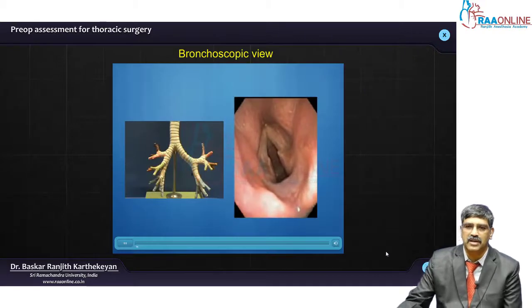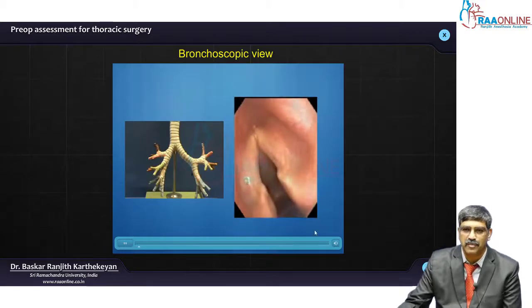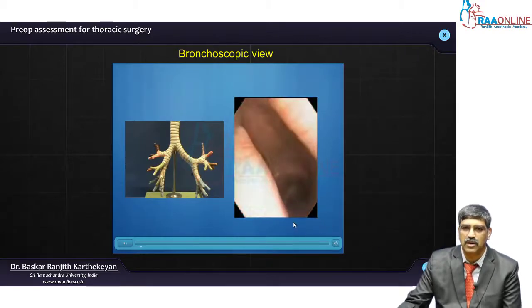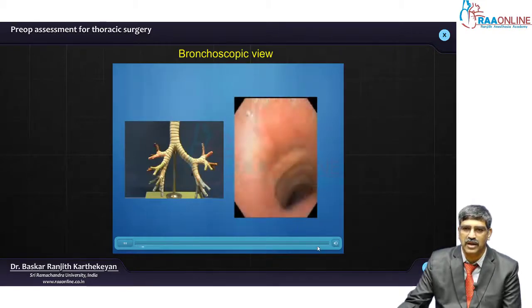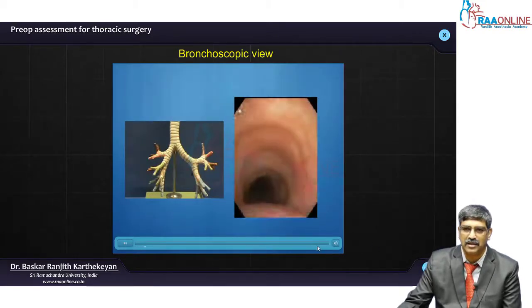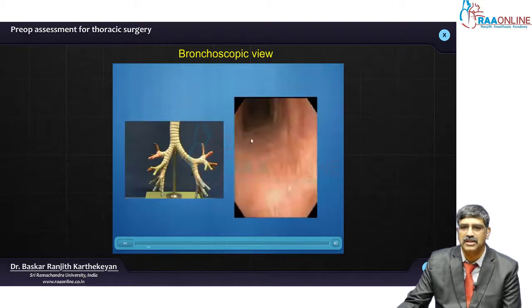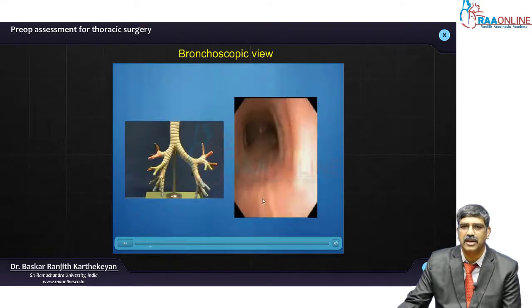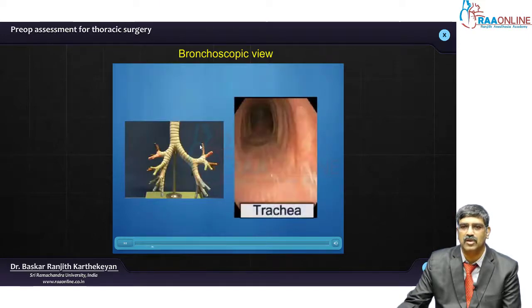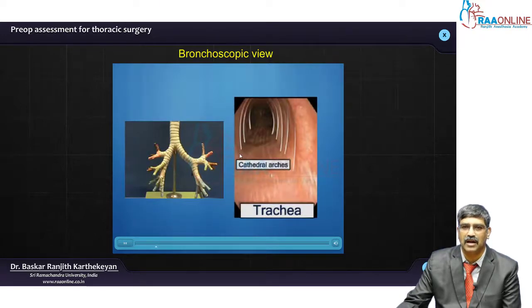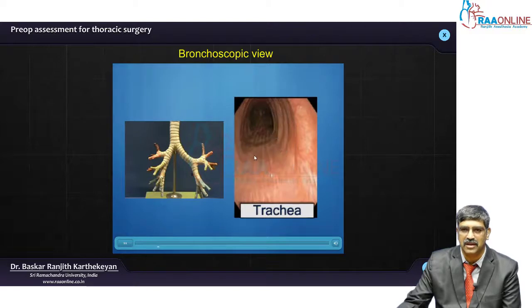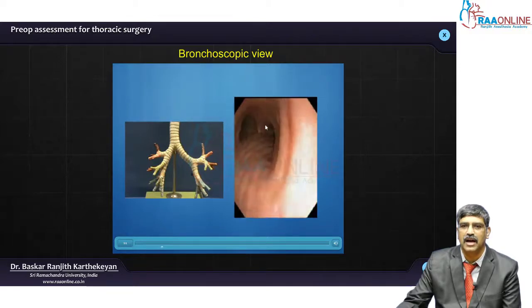So, look at the various segments. Here we pass the vocal cord and go into the trachea. This is a bronchoscopic view. As you enter the trachea, you can see what is called the cathedral arcs — this is the trachea and you can see the cathedral arc.